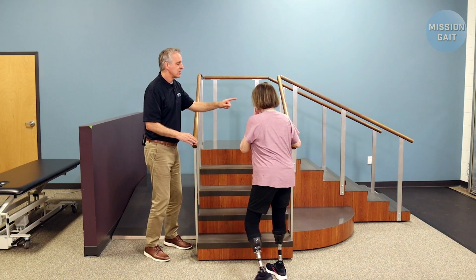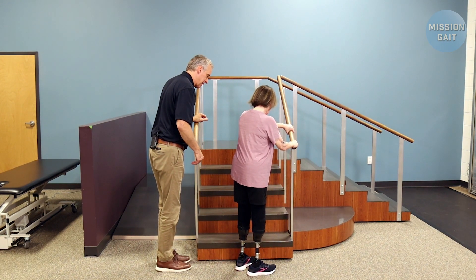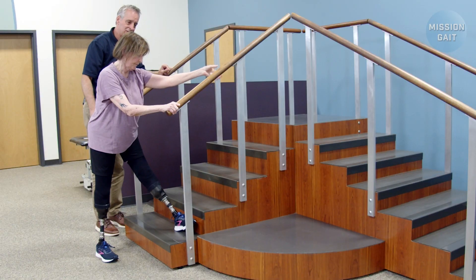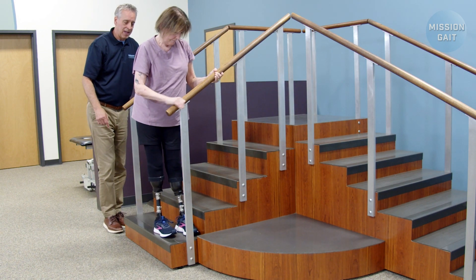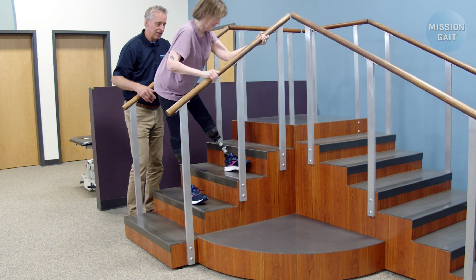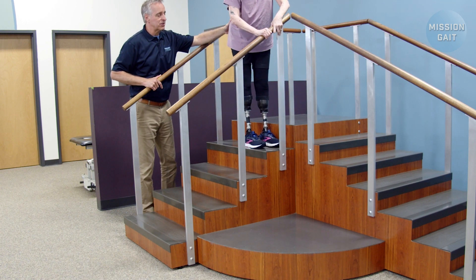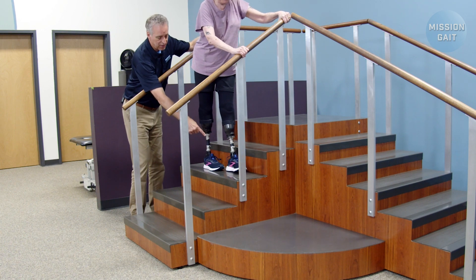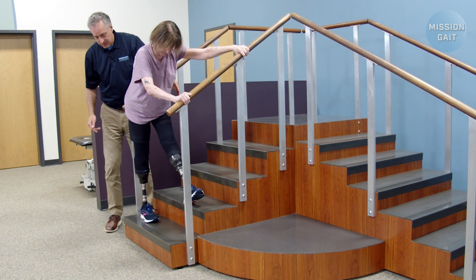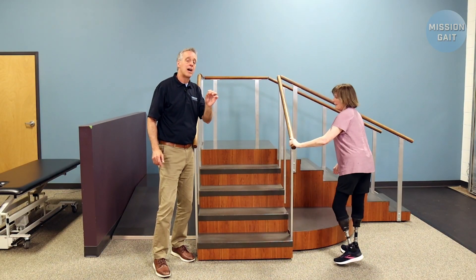One more time — we're going to assume we only have one rail. Face that rail, put both hands on it. Step back towards me a little bit. Take this foot, put it up onto the step deep into that area. Keep that knee straight, pull yourself into it, and bring that other foot up, then repeat. If you don't have enough room, step back a little with the back foot so that when you land it, you have more room to move on the next step. Coming down the steps — give yourself room, step wide on the step out front, and give your other foot room to be closer to the back. Keep those knees locked out the entire time, up and down.